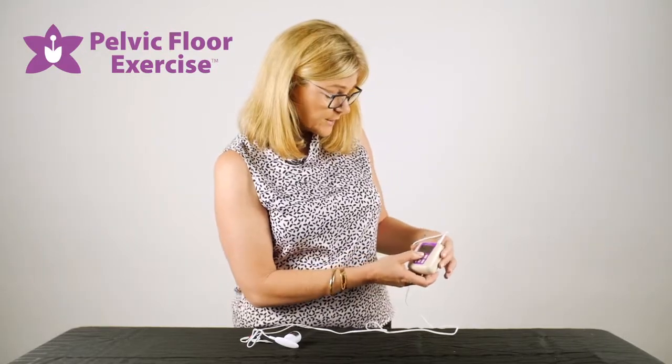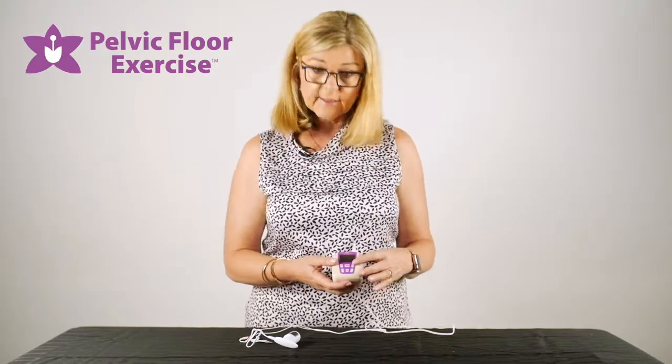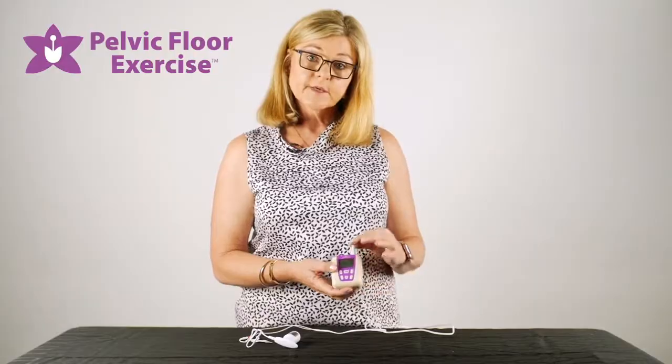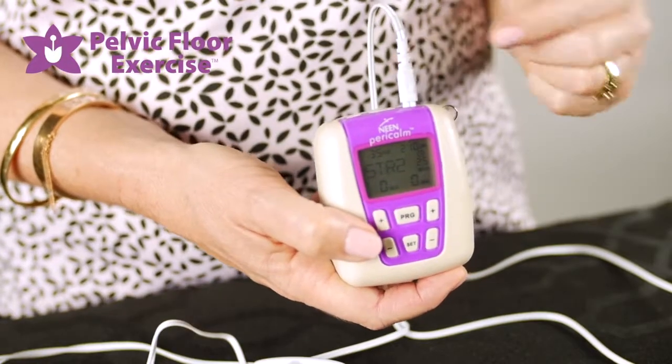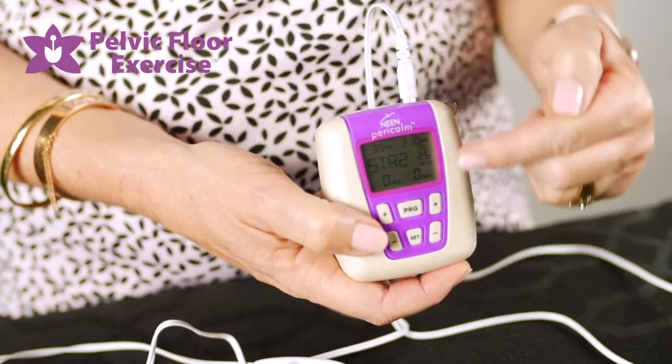Once you've reached the program you're using, you can start the program. To do that, use the plus and minus buttons, but make sure you use the plus and minus on the side that you have the lead and electrode plugged into, otherwise it won't work.